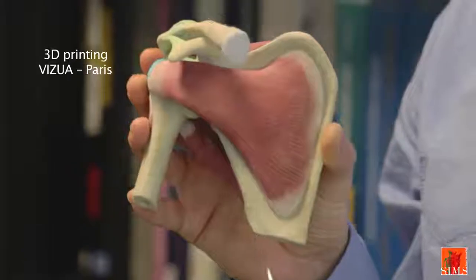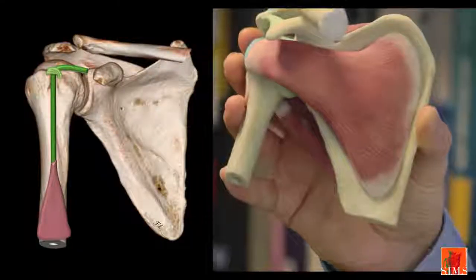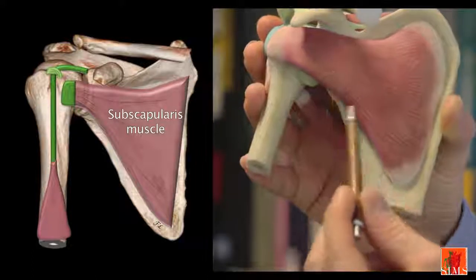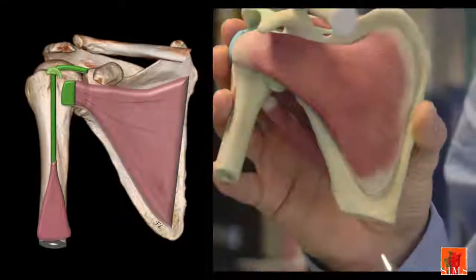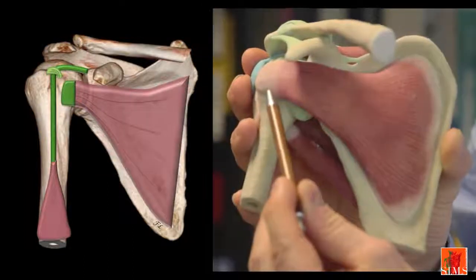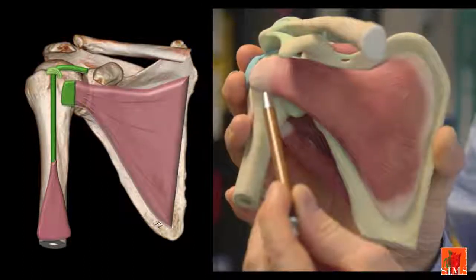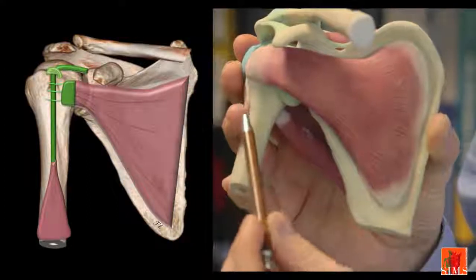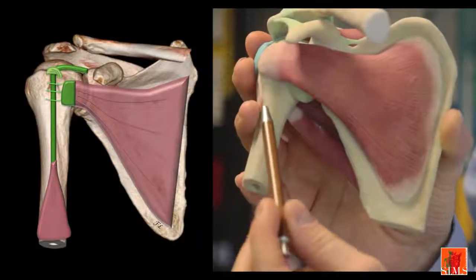The subscapularis muscle is a thick, powerful triangular muscle arising from the anterior aspect of the scapula. It is directed outwards, it is multifasciculated. It ends in a powerful tendon which inserts on the minor tubercle. It also gives off some fibers that form a bridge over the intertubercular groove, thus holding down the long biceps tendon.